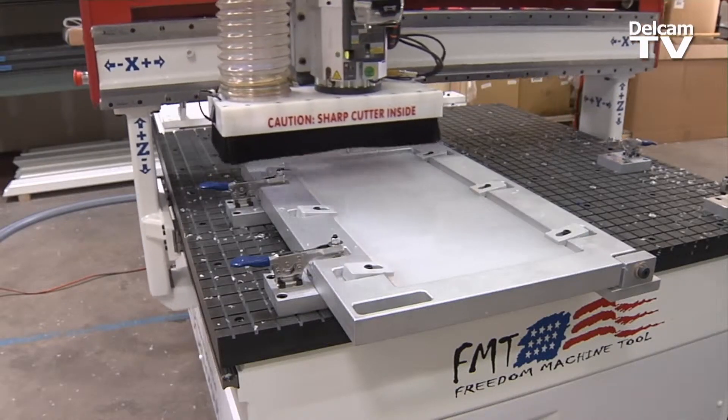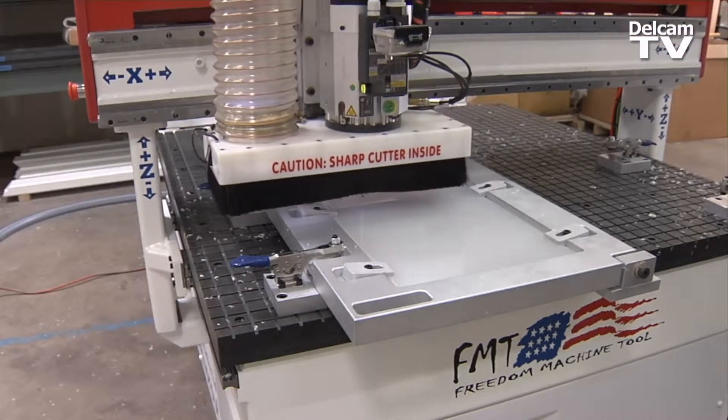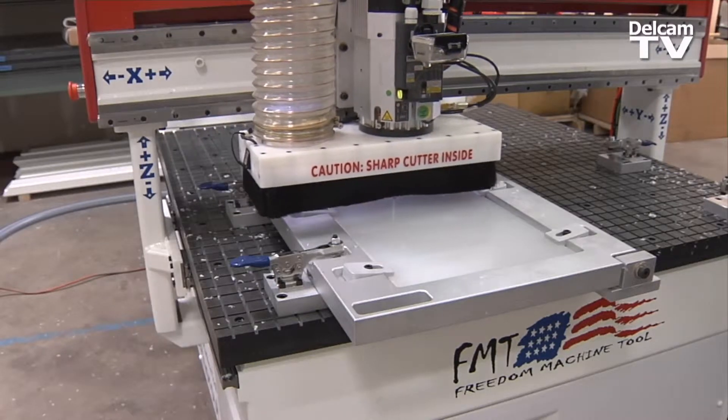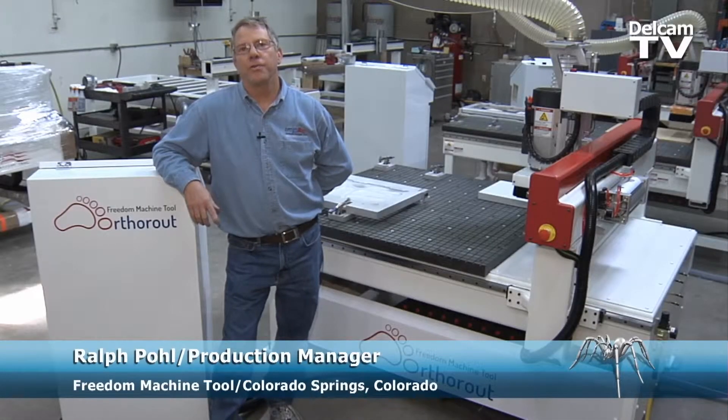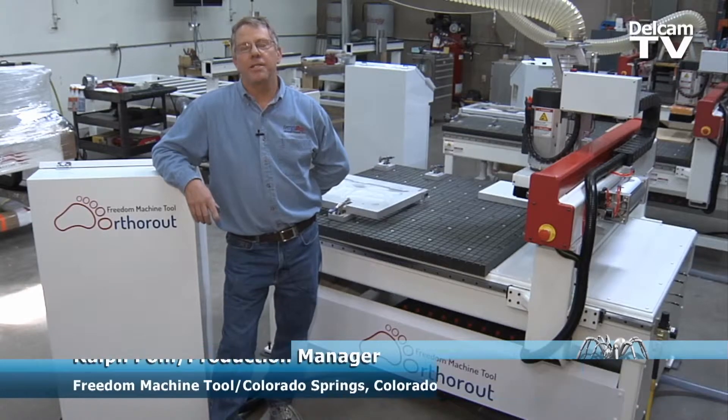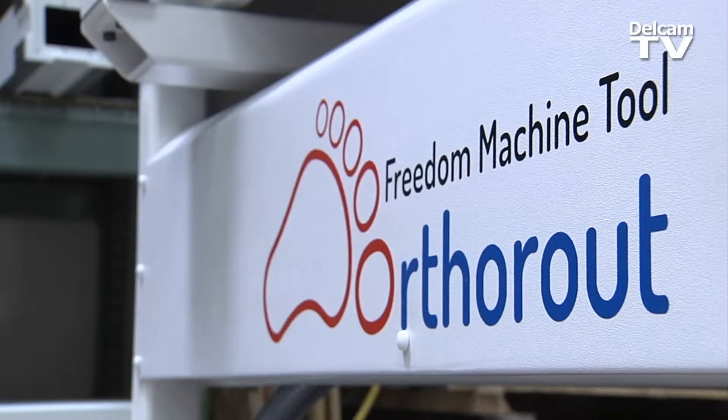The Freedom Machine Tool OrthoRoute machine is going to last a long time and you're going to get many years of reliable, constant, accurate production off of our machines. Hello, my name is Ralph Pohl. I'm production manager for Freedom Machine Tool. I'm here today to tell you all about the Freedom Machine Tool OrthoRoute.